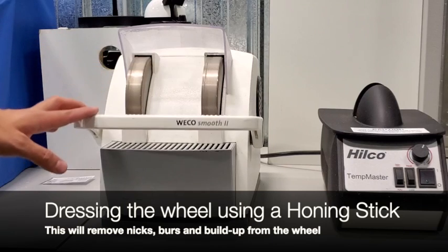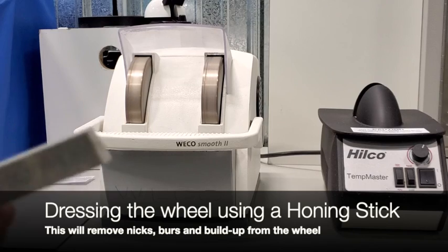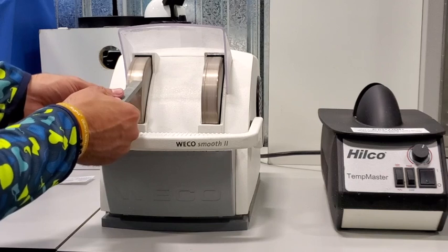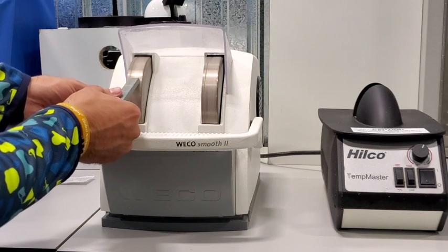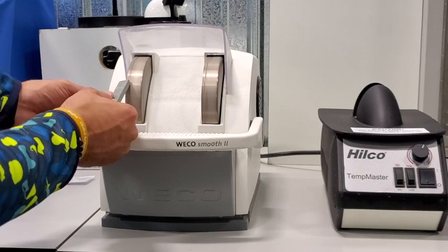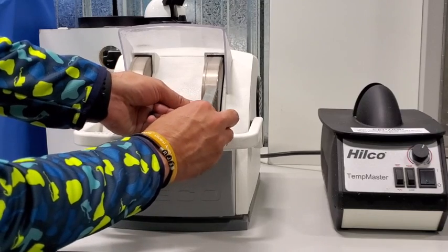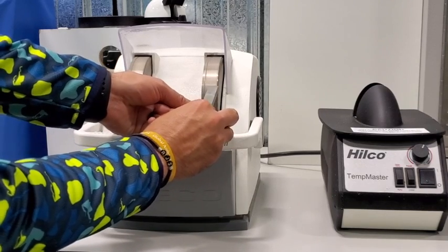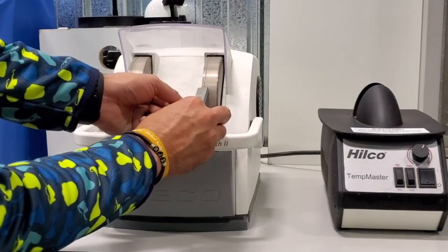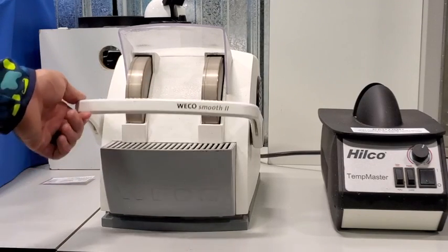Then you're going to take your honing stick and lightly go back and forth on your wheel. As you go over any nicks and burrs, you might actually hear them. This one over here sounds pretty good. We'll jump over and do this one. And this one seems like it had a few nicks and burrs because I can hear them. But just like that, our wheels have been dressed.